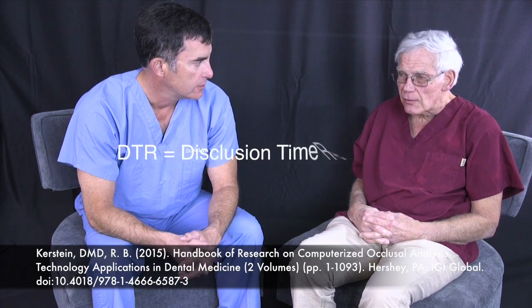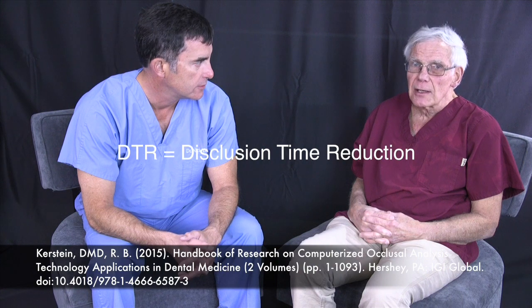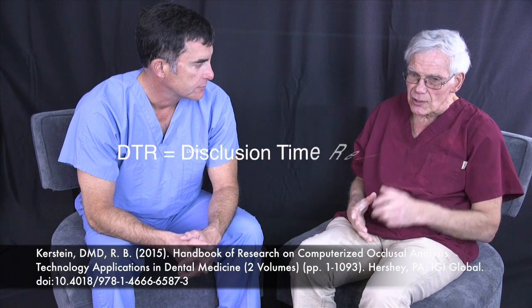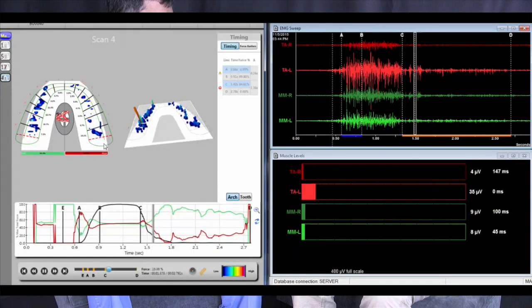I believe also that we should be looking at the factors that initiate occlusal disease or identify the clinical signs and symptoms that are present. DTR is a component of the entire program with digital occlusal analysis. So what you're saying is the fact that we can measure something and actually reproduce it and keep a record and track it over time is extremely important.